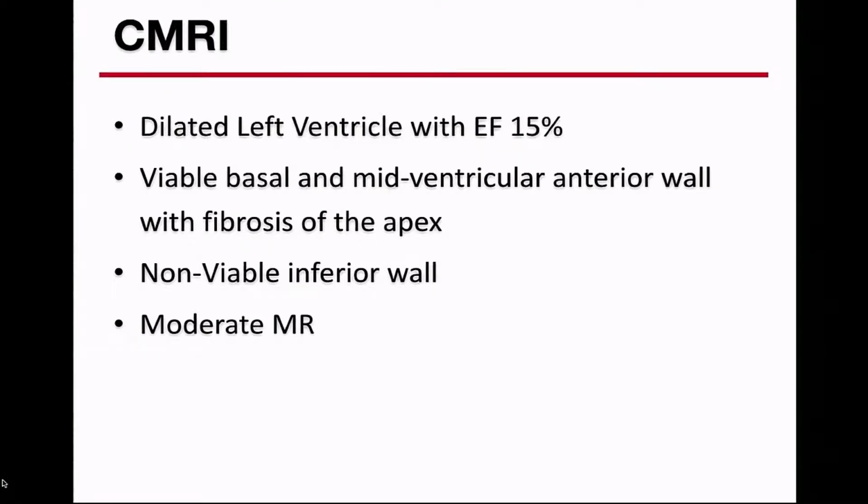Do you remember if the stent on the right was placed in the context of an MI? Not that I recall. It wasn't done at our center. It could be stent thrombosis as well, because the way it looks, it's a long occlusion and stent with collaterals that build up from the RV branch to the PDA and also the LAD. So it tells me that probably he had a thrombosis of that stent, and now he's got a non-viable inferior wall, and basically what you have to focus on is to treat the left system, right?